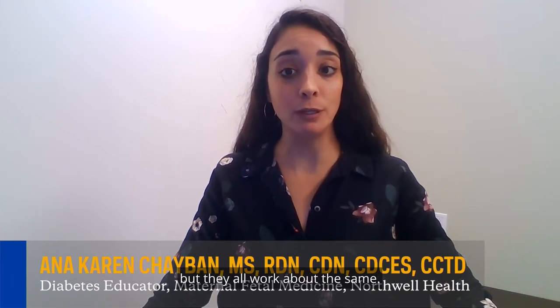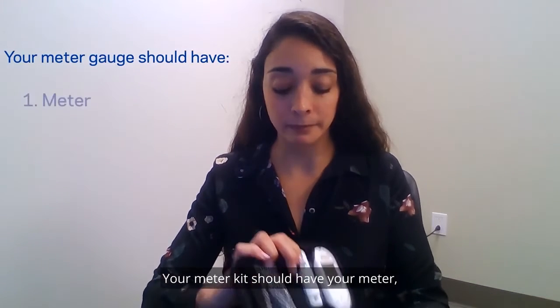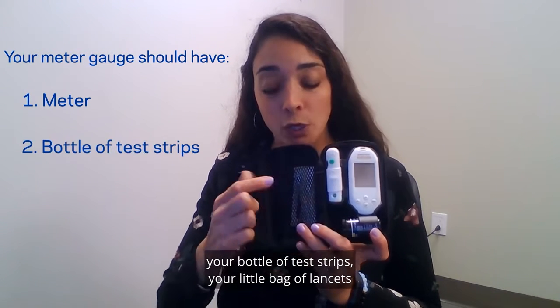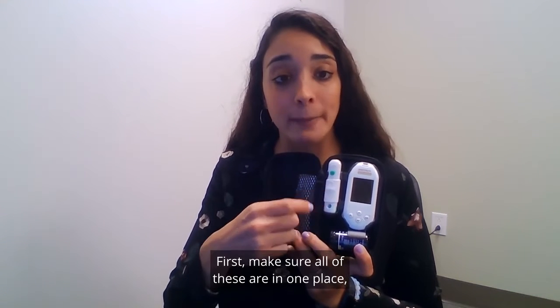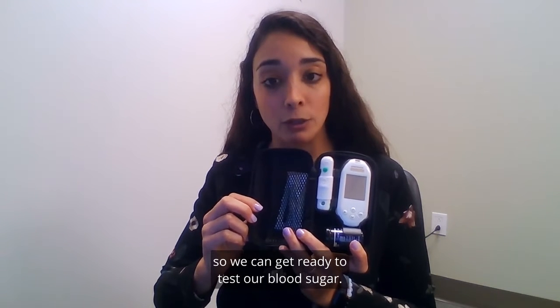Depending on your insurance you can get different types of meters but they all work about the same. Your meter kit should have your meter, your bottle of test strips, your little bag of lancets, and this tool which is called a lancing tool or device.